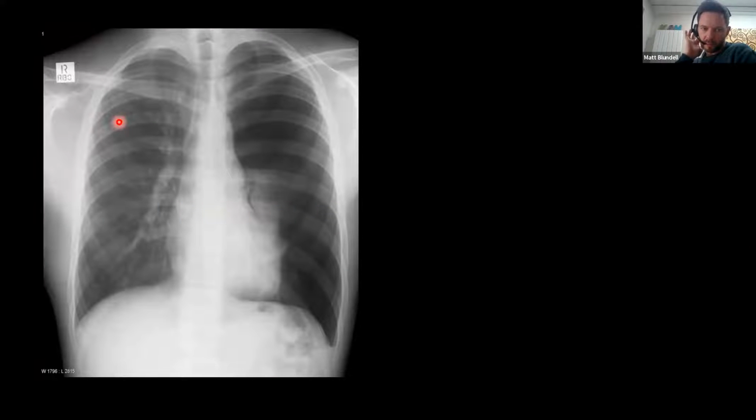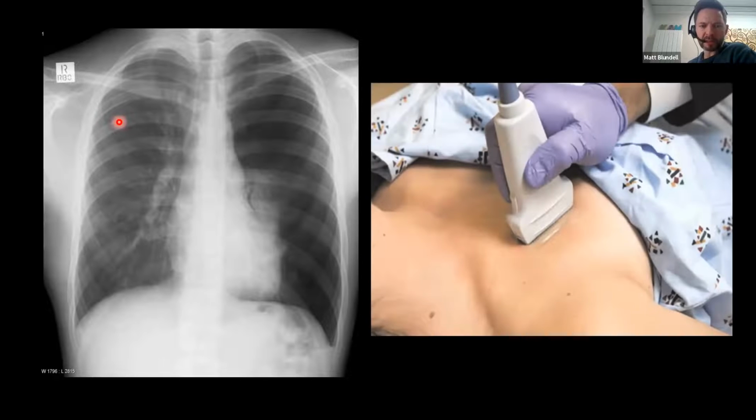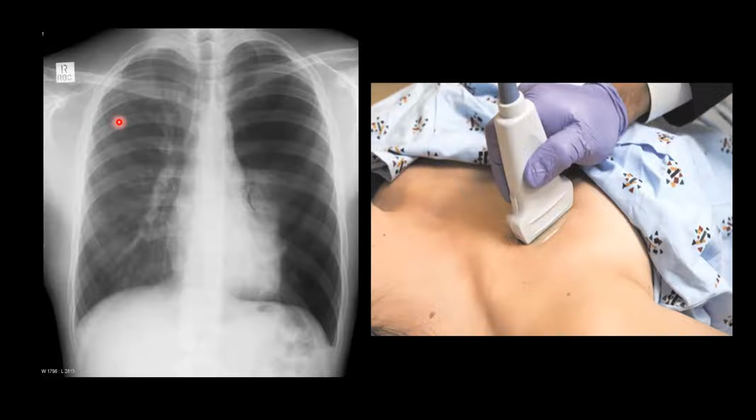So obviously, I'm sure everyone's fairly competent at being able to look at a chest X-ray to diagnose something like this, a large pneumothorax. However, a lot of patients, especially our trauma patients, will come in lying flat. And if you ever try to look at a supine chest X-ray to diagnose pneumothorax, I'm sure you'll recognise it's not that easy. We also see a lot of patients with underlying chronic lung disease. So if someone's got a large bulla, I'm sure you've seen a chest X-ray where you're not quite sure if it's a bulla or a pneumothorax. Enough to be quite difficult on a chest X-ray.